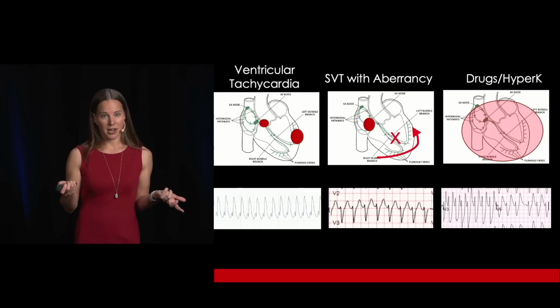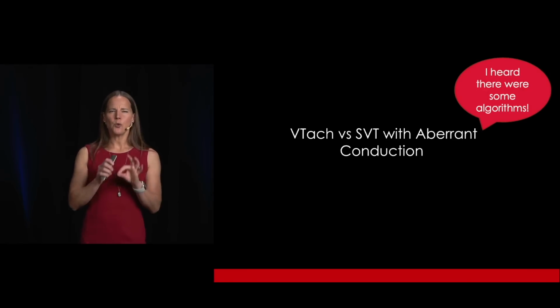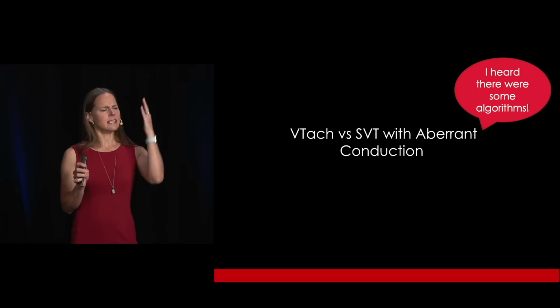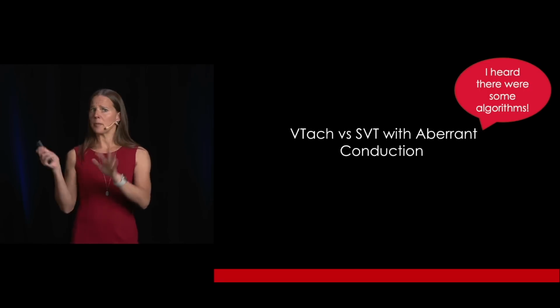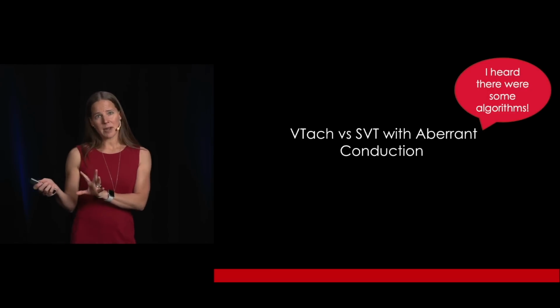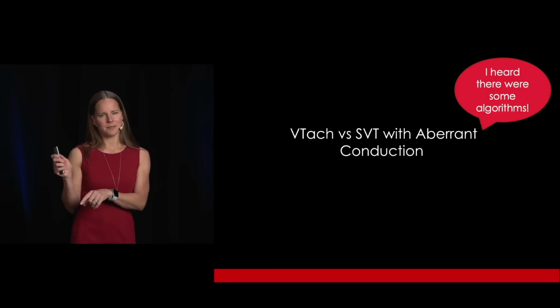And that's why it's wide and fast. Okay? Now, when I was training, I was taught that you always need to scrutinize the ECG and determine, is this VTAC or is this SVT with aberrant conduction? Remember, most of the time it's going to be VTAC, but about 20% of the time it might be SVT with aberrant conduction. So I learned about these algorithms.